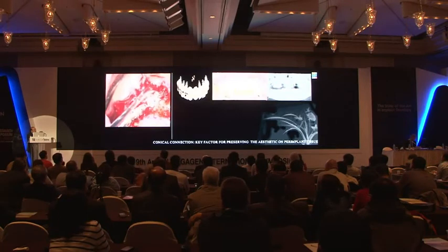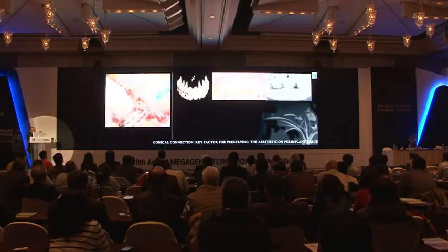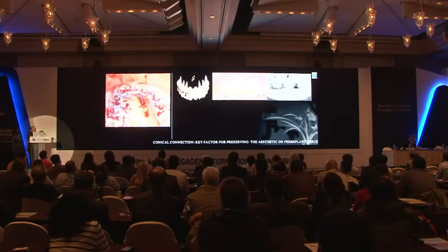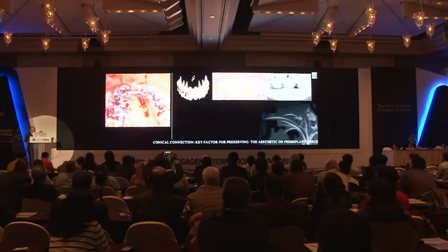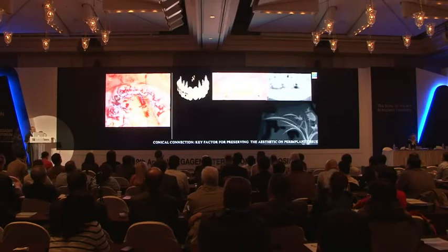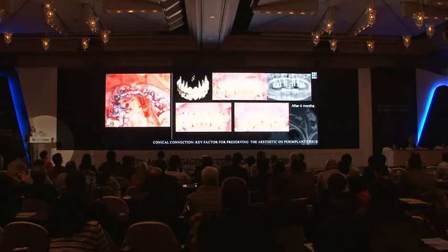And also, as you can see, we put some more biomaterial on the buccal bone plate and we covered it with a collagen membrane. We decided not to place the implants in the central incisor area because that is the most critical aesthetic area, which we will restore with a connective tissue graft. This is the control after 4 months.